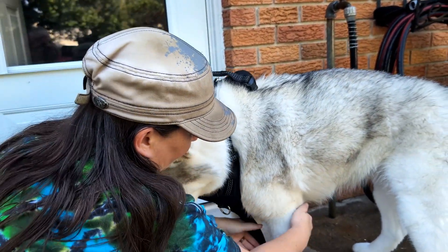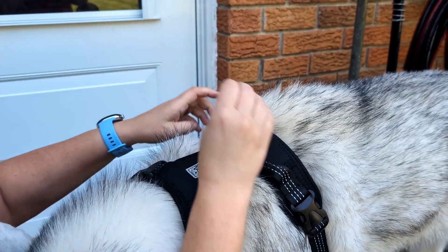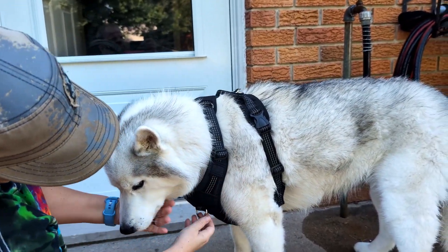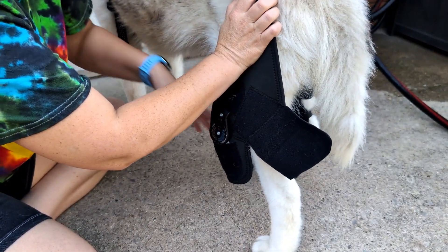To put this on, you want to adjust and put on the front harness part onto your dog first. The harness is really easy to adjust, and this can just be used as a standard walking harness. You'll notice even on the front of it that it has a little clip on the front of the harness. Once you get the front harness fully adjusted, then you are going to go to the back part.